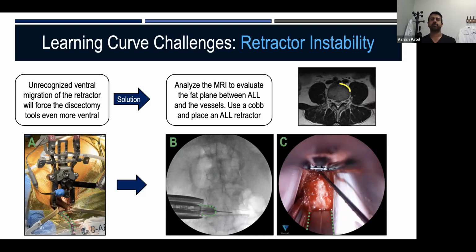I haven't. I think what we're doing is we're accommodating for the retractor instability in the prone position, right? And so we're trying to add anything that we can to increase stability. But the key to perform prone lateral right now, outside when we start to think about the technologies that we can introduce to make this more reliable and more reproducible, is going to be patient stability and retractor stability. And the key is going to be, how do we anchor the retractor to the spine?